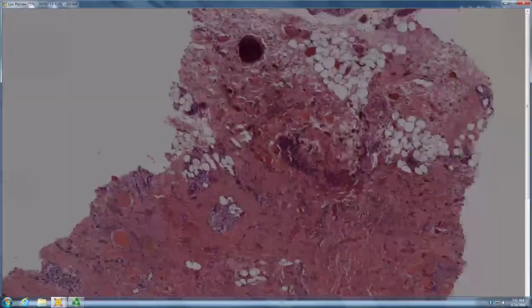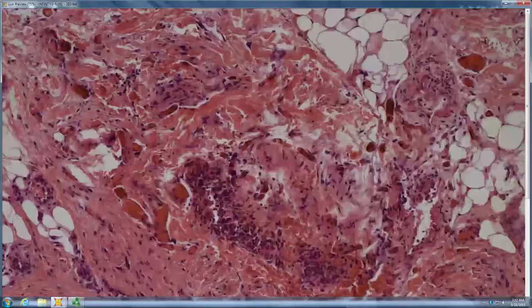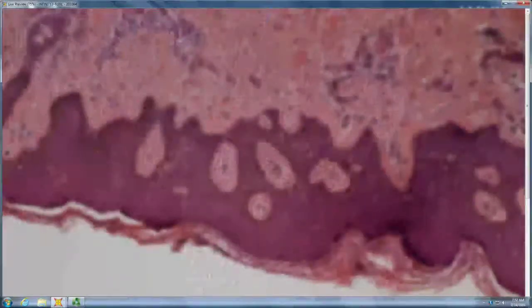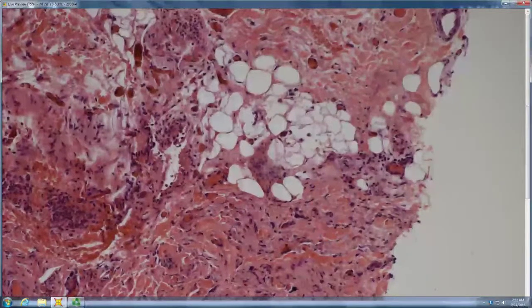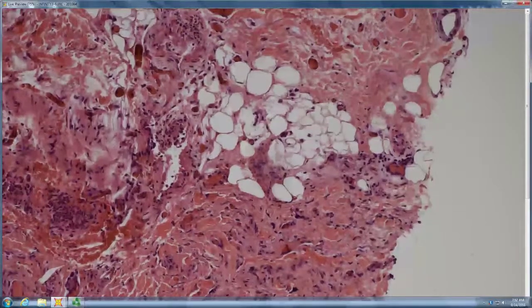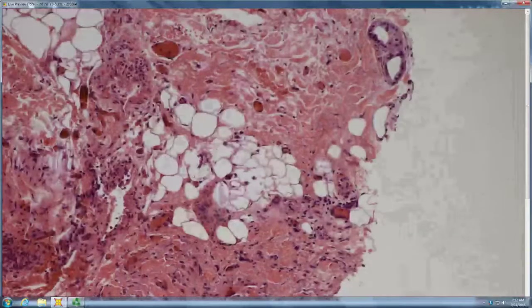Punch. Looks like we got two pieces here, that one and this one. Some scattered lymphoid infiltrates, vascular, interstitial. There's a lot of neutrophils. Yeah, neutrophil debris, all kinds of things going on. So you'd wonder about an LCV. Giant cells. What about your dermis and cellularity? It's a little hypercellular. Is it more hypercellular superficial or more hypercellular deep?